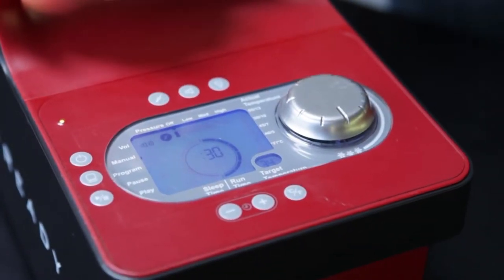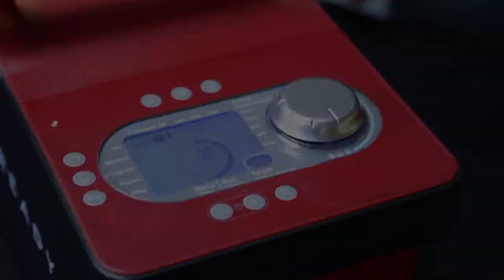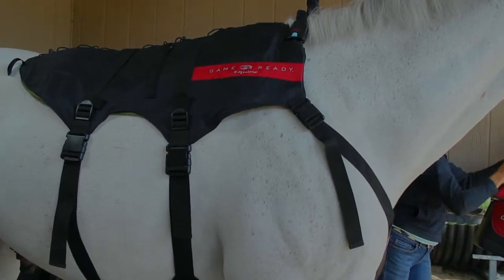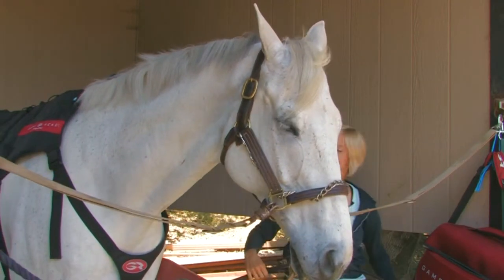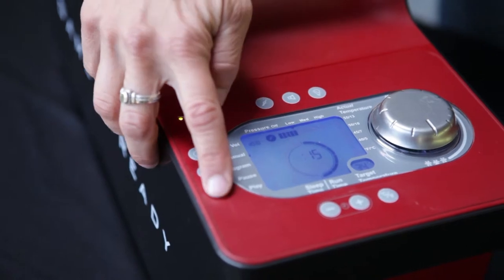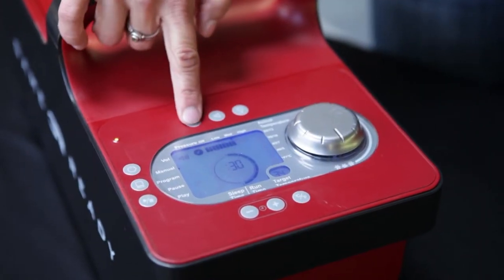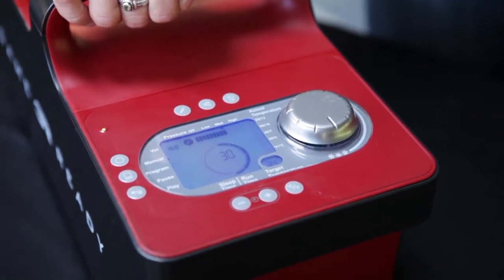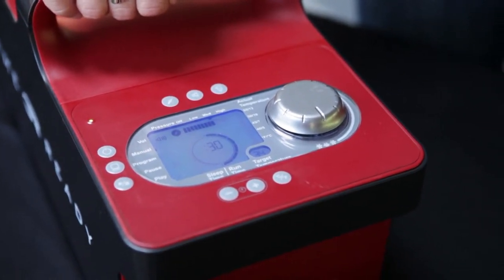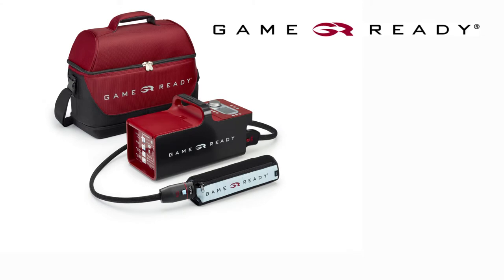Begin initial treatment with no pressure in order to acclimate the horse to the sensation of the backwrap. If after several minutes there are no signs of aversion from the horse, begin administering cold therapy at low pressure. Advance to medium pressure only when your horse appears relaxed and comfortable. Medium pressure should be the highest setting used for the backwrap, as the product performs optimally at this setting.